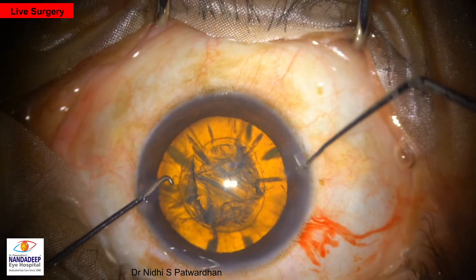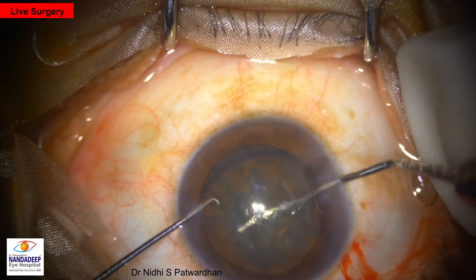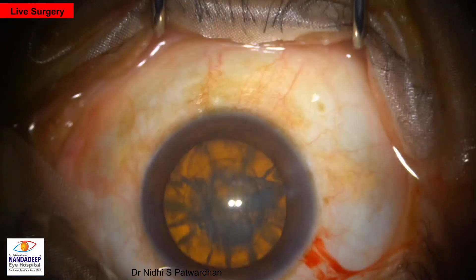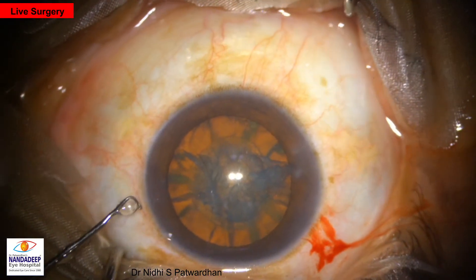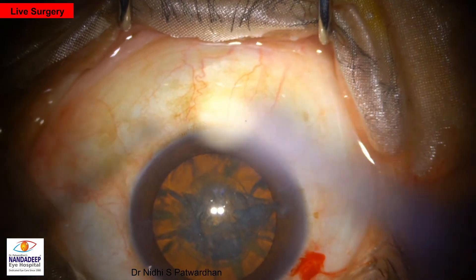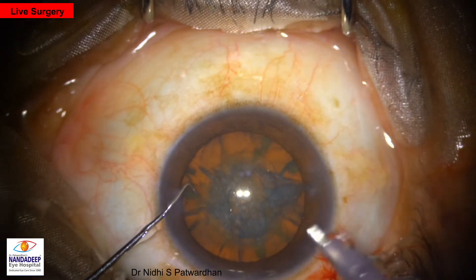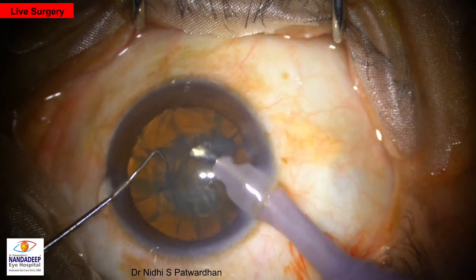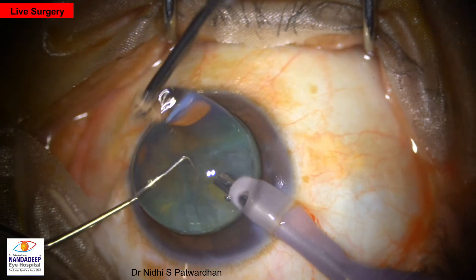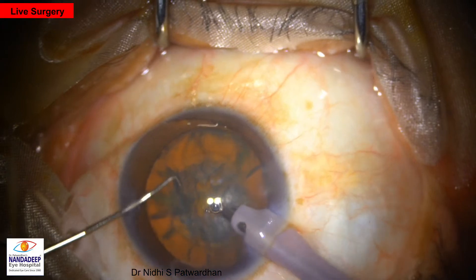This is a live surgery. The cataract is grade 2. CCC has been done, hydrodissection has been done, and the nucleus is being rotated now. The patient is on topical anesthesia. Surgery is being done by Dr. Nidhi Patvardhan using the Constellation phaco machine with Venturi settings. Power used is 100% Ozil in linear mode, so the foot switch controls the power delivered.